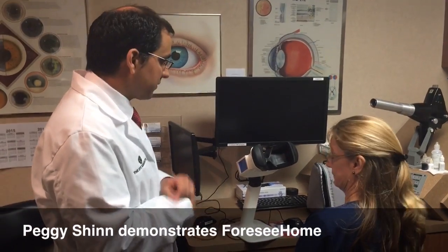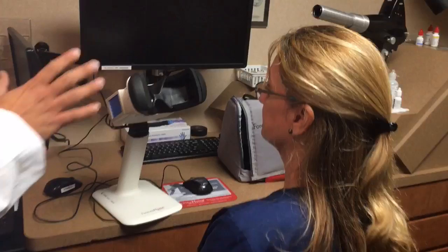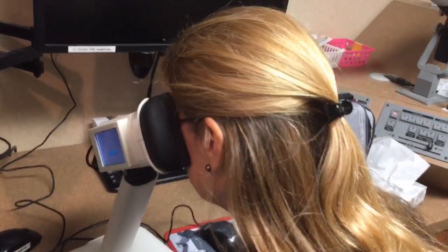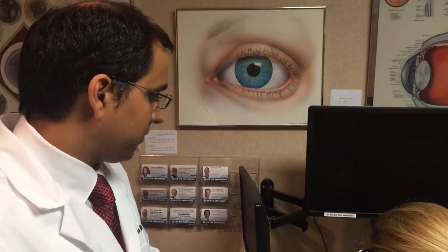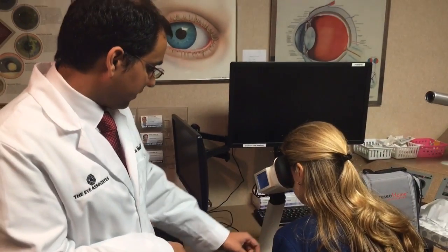So Peggy, what I'm going to have you do is you have your glasses on as you usually wear, and we have pretty good lighting in the room. I'm going to have you put your face right into this soft styrofoam thing. Basically, your right eye will be covered by the block, and the left eye is the one that's exposed. There's a mouse on your right side that you're going to utilize.